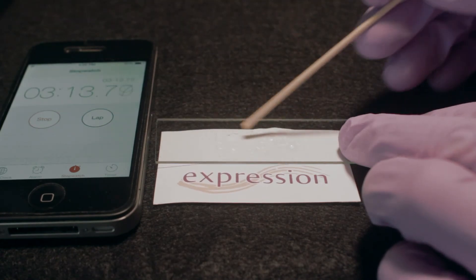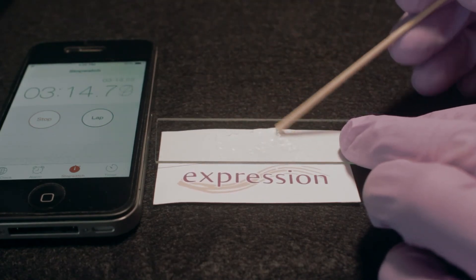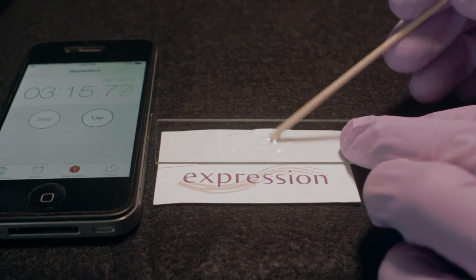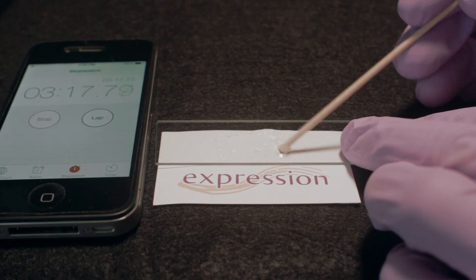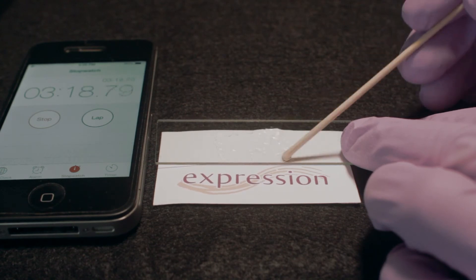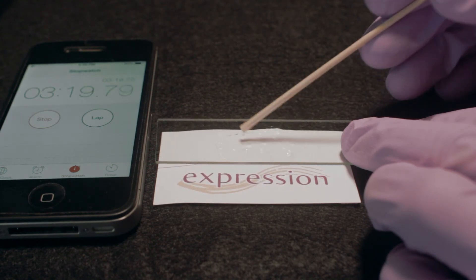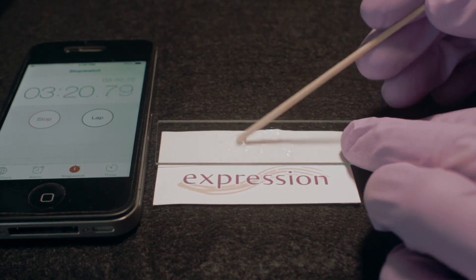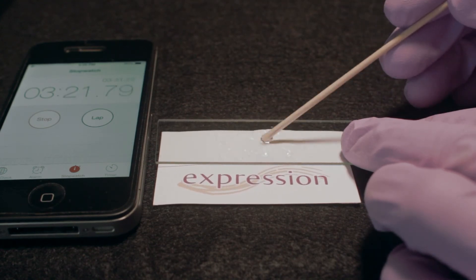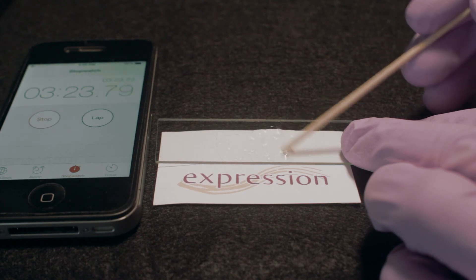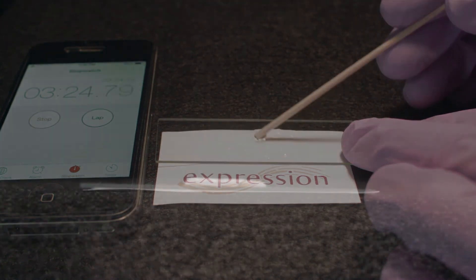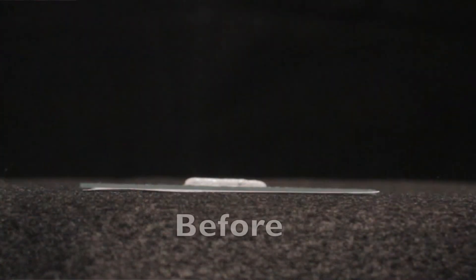I've skipped ahead a couple of minutes here, and we can see the timer reads 3 minutes and 15 seconds from our initial injection of hyaluronidase. In that time, we are able to demonstrate nearly complete degradation of the expression hyaluronic acid gel.